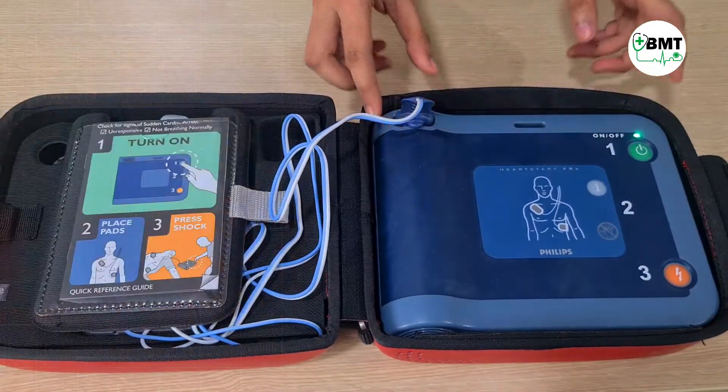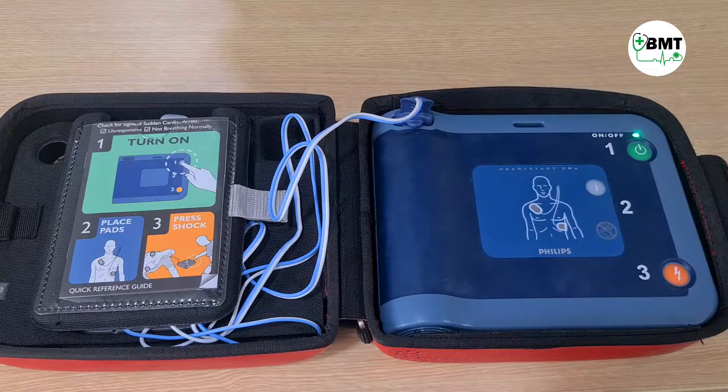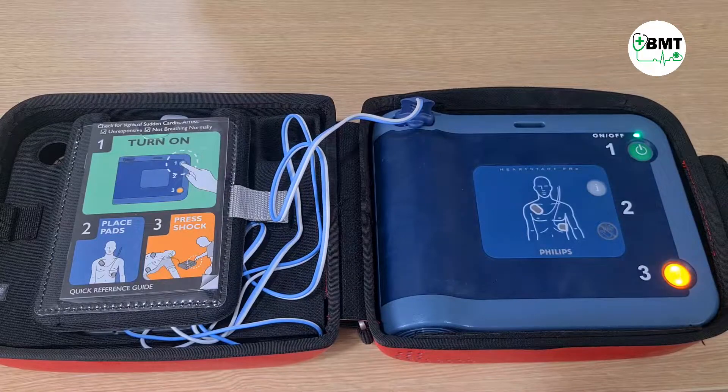The device begins a self-test. If this is an emergency, press the green on-off button. Shock button test: if the orange button is flashing, press it. Verified.